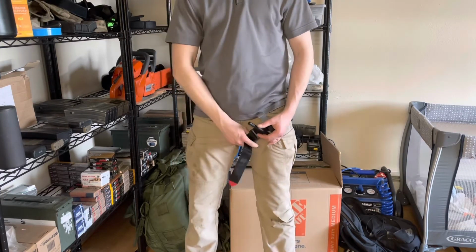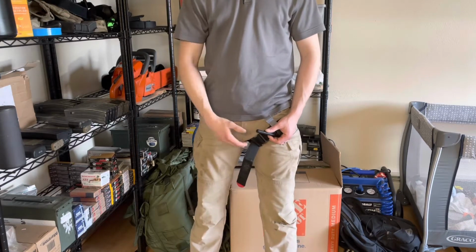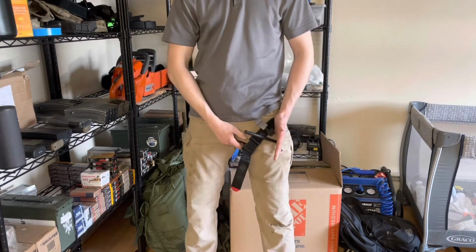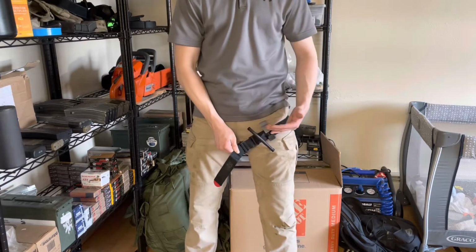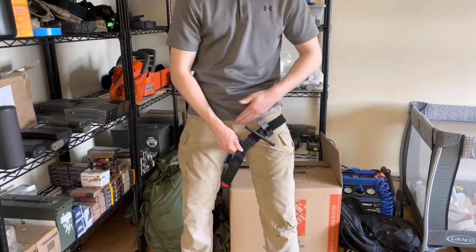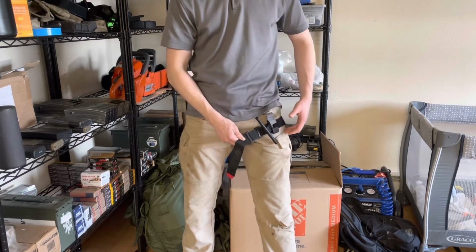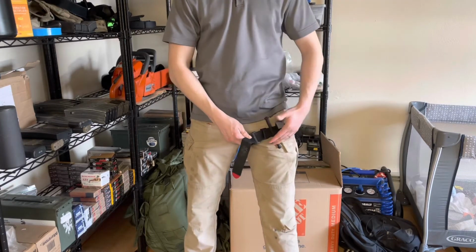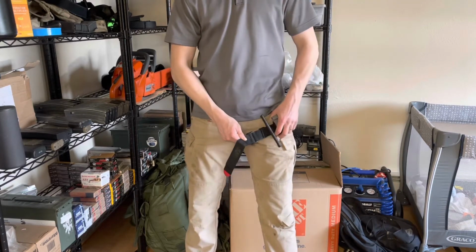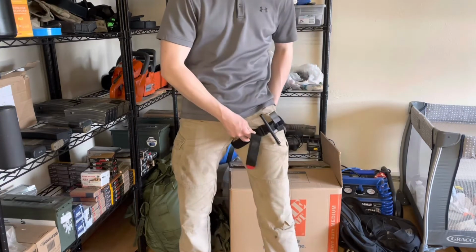Make sure you don't get any of the material of the individual's more private areas caught in the tourniquet band. Obviously, this is more obvious with males, but it's also a consideration with females. Just make sure you're not on anything sensitive. You want to be on the meat of the leg with no body parts, flashlights, pens, or anything else in the band with the skin. You want a good connection to the actual leg itself.